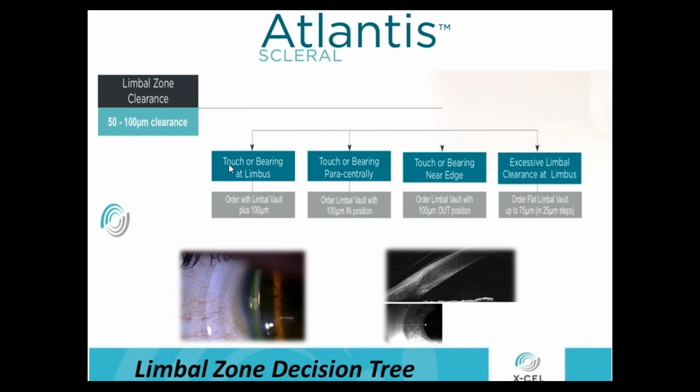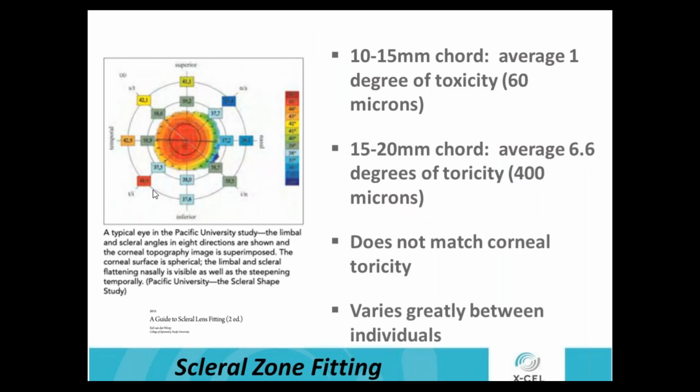If I've got it at the limbal area, I can simply increase that limbal zone, moving it up at the same area it's in. So you have those options, up or down and in and out, okay? Very unique to the limbal zone and designs, but we need all these options, even if they're not utilized that often. We do see these patients, and we're trying to fit as many patients as we can.